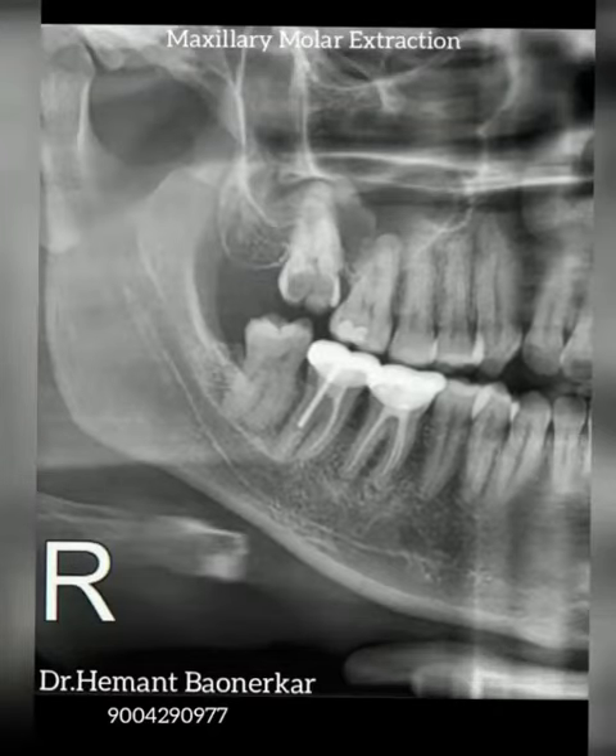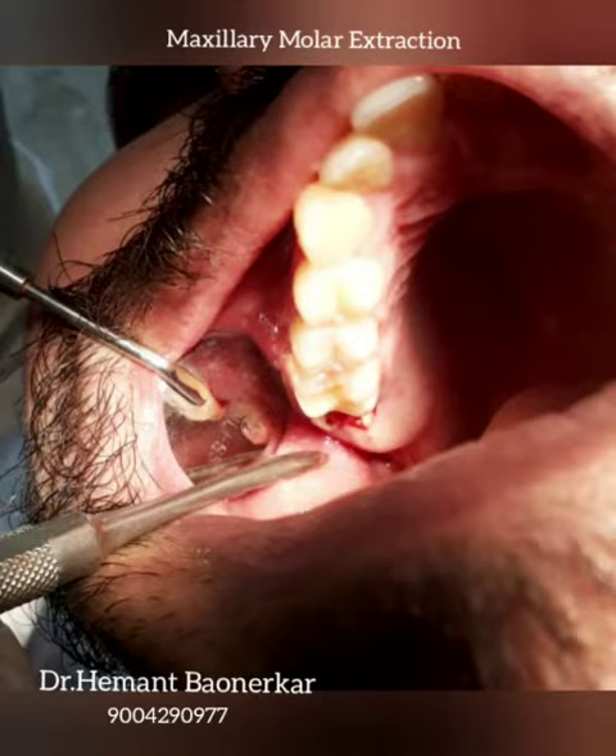Hello friends, now we are going to see how to extract a maxillary molar tooth. Give attention to the radiograph — the maxillary molar is very close to the maxillary sinus. This is a clinical picture of the second molar tooth.